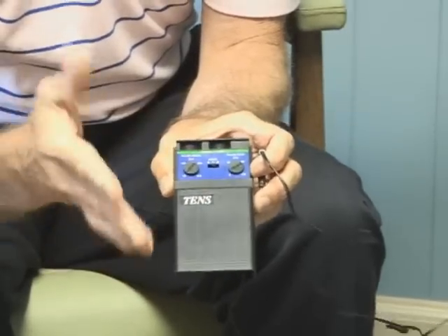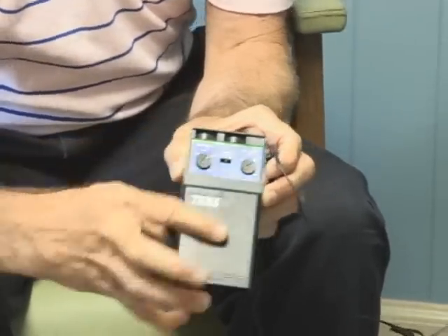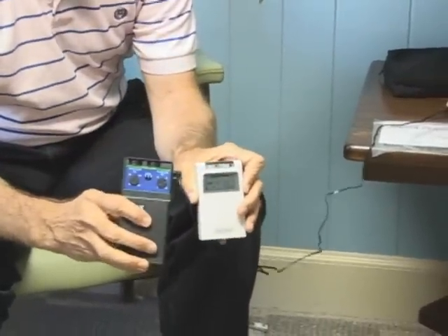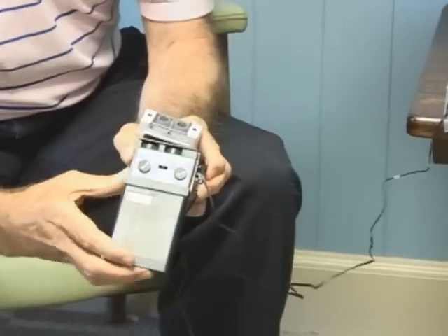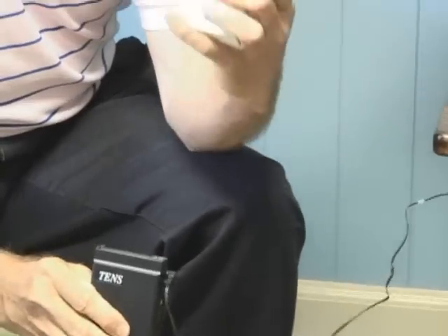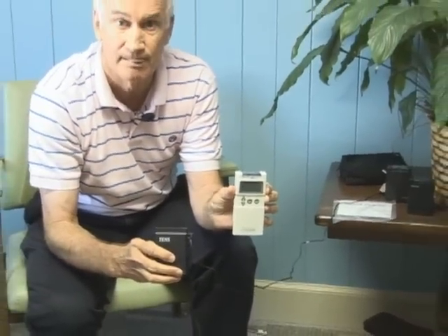We'll cover more features in other videos. But the key difference between a digital unit and an analog unit is that with an analog unit you set your settings by hand, turning knobs. With a digital unit, you have to use buttons and watch a screen to see what's going on. A lot of people prefer to just turn a knob and control it that way.